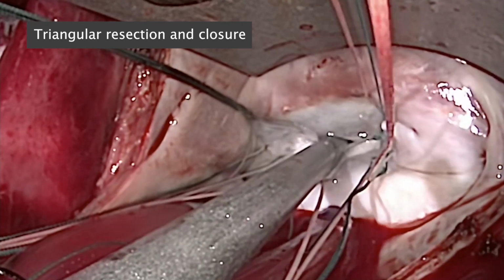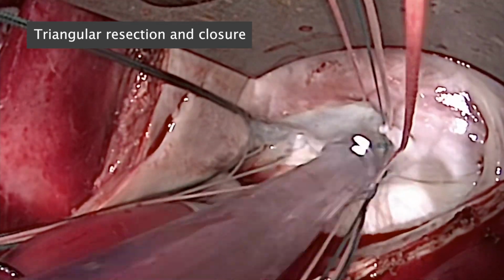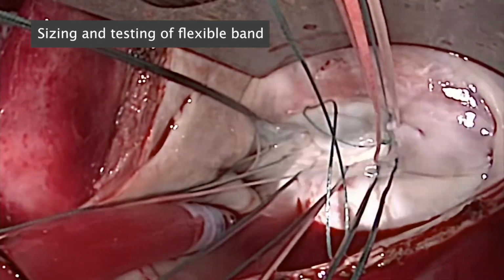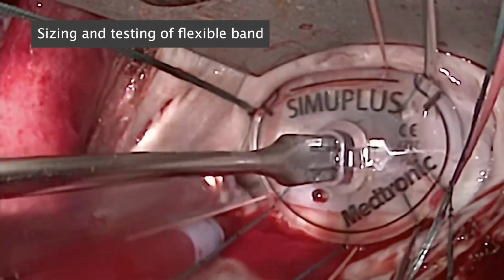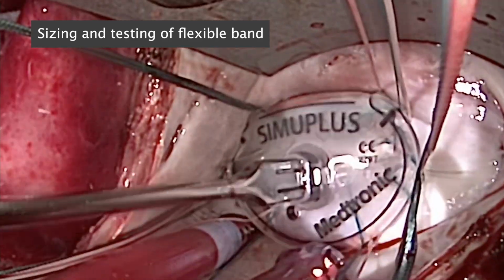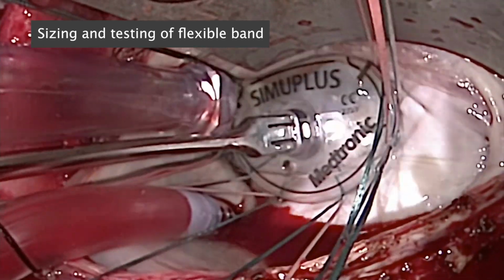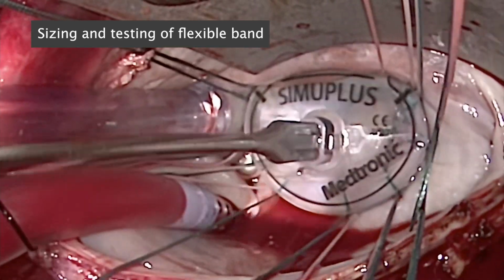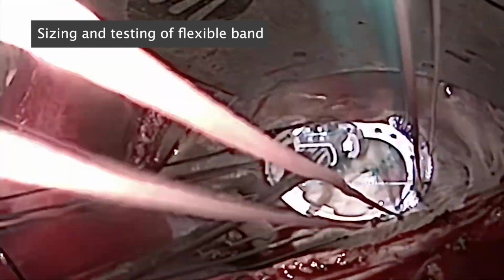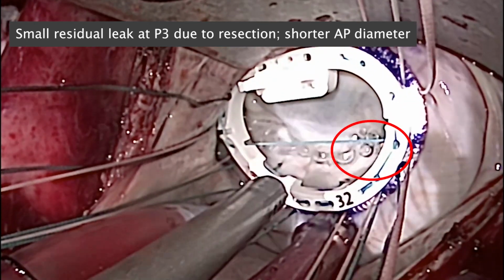We now size the annulus, and we do what we call a functional measurement or functional valve sizing, where we're filling the ventricle, in this case with del Nido cardioplegia, and sizing the entire annulus with the ventricle full. Here we are going to select a flexible 32 millimeter band, and we will intentionally tailor this band to optimize the anatomy.